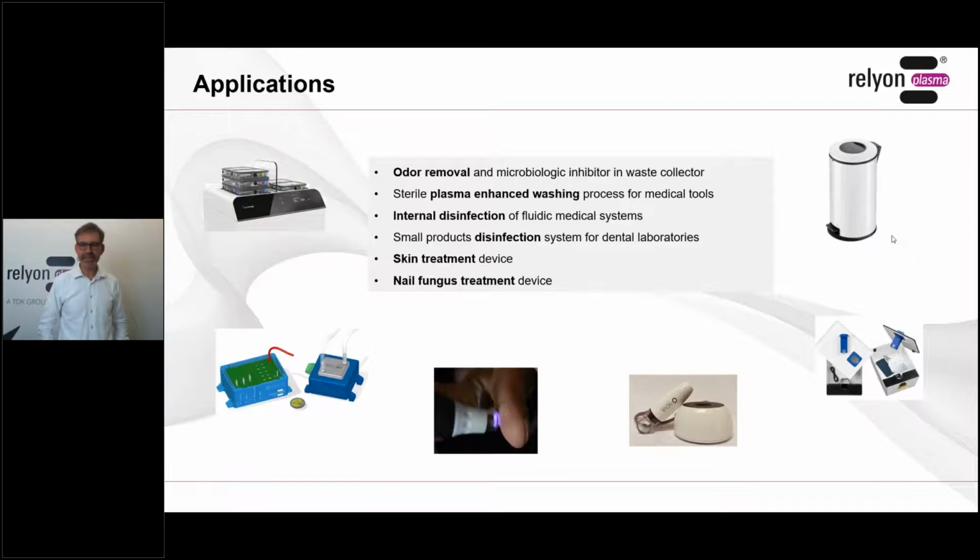And if I can add to this water film, a water film that is heavily loaded with oxidizing components, this aggressive film will cover the surface of these microorganisms. And it will not only be there for the time that I have the plasma in an active process, but it will stay there for maybe some more minutes. So it's like having a longer period of interaction.